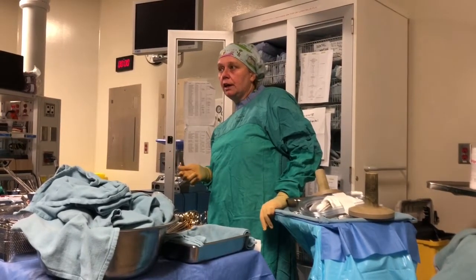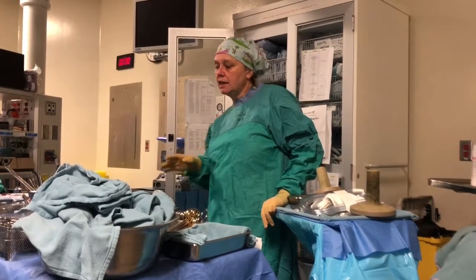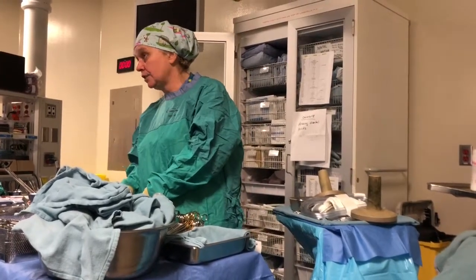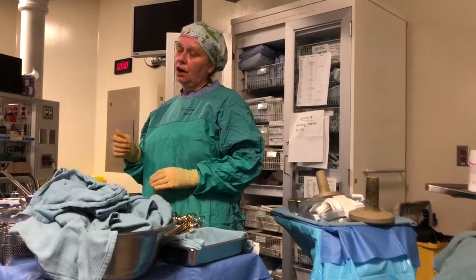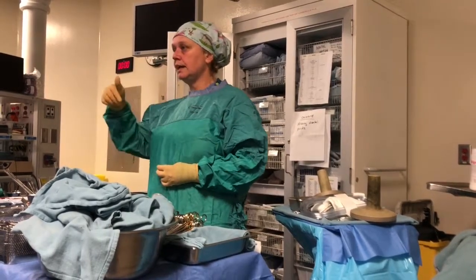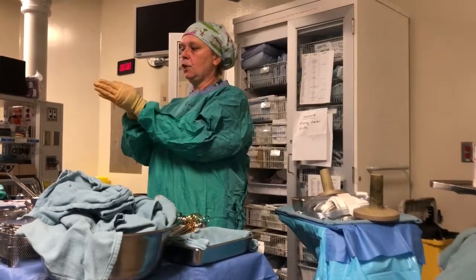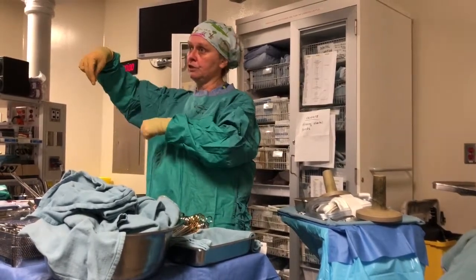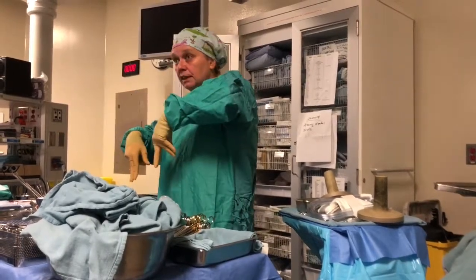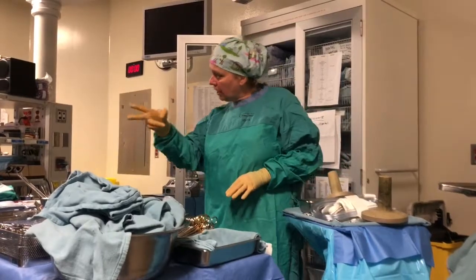Now with an aorta, you would always have, it's just common knowledge, at least here, for all of our vascular surgeons, you have silk ties, or silk sutures. So that as soon as they get in, and I was telling you about the aorta, they cut the aorta open, and when they open that aorta, they'll clamp it first, of course, and they'll just bleed out. So they're going to clamp it, right? Once they do that, that's when they're going to use that heavy scissors, and they're going to cut it, right?